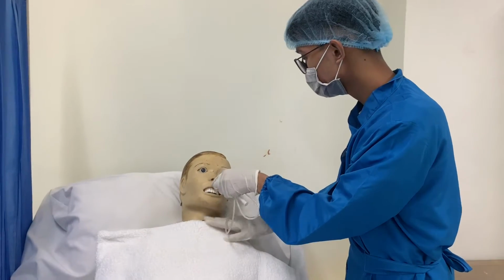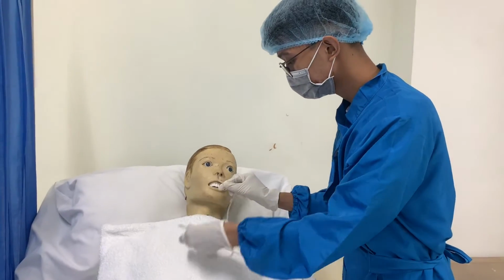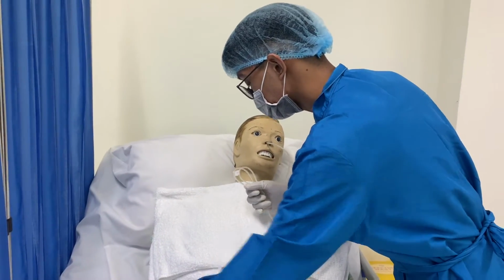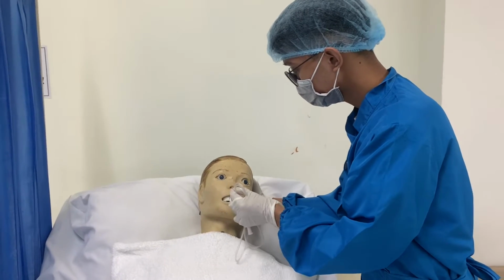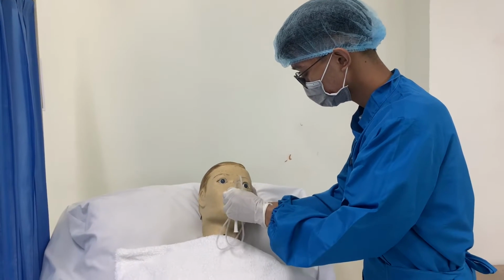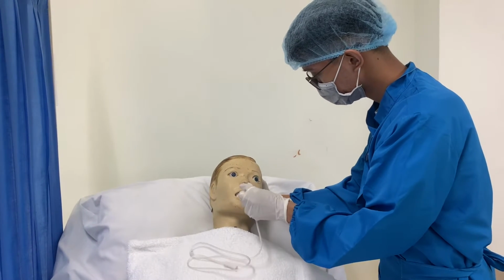When the pharynx is reached, instruct the patient to touch his chin to chest. Encourage the patient to sip water through a straw or swallow, even if no fluids are permitted. Advance the tube in a downward and backward direction when the patient swallows. Stop when the patient breathes. If gagging and coughing persist, stop advancing the tube and check placement of the tube with a tongue blade and flashlight.